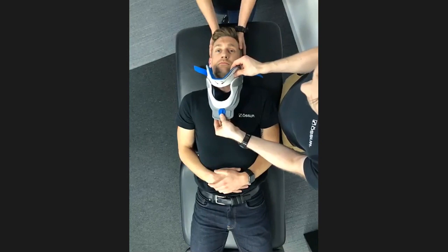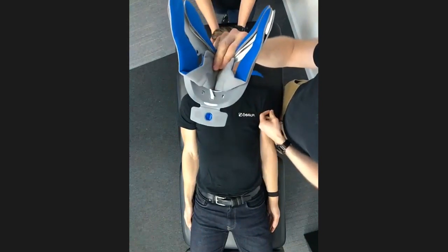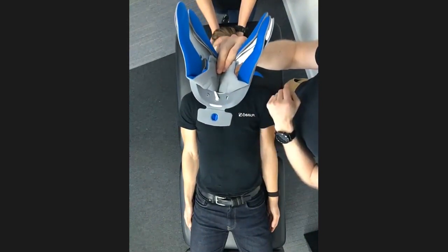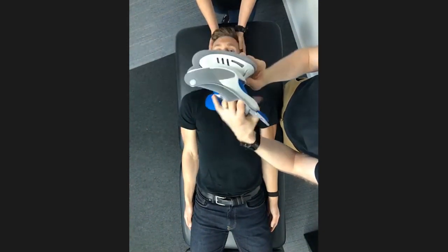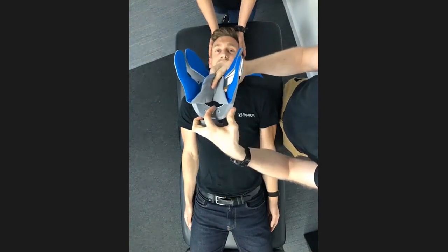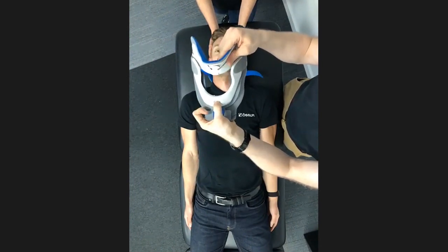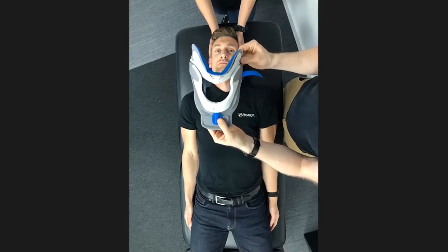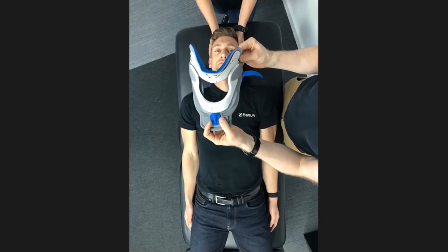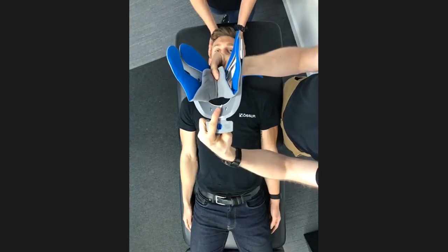And before we do this, I just wanted to show you the locking mechanism. So if you look in here, there's a locking mechanism and there's a lever built in here. For normal adjustment, we'd push the button and we can adjust that. However, if we lock this at the back and it's left to lock, you can see that it's completely locked. I can't adjust that. So this is particularly good if the patient has a cognitive impairment or you're concerned with compliance, so you want the collar height to remain the same. If you have further concerns, you can also trim this section off. So you can adjust that if you need to.